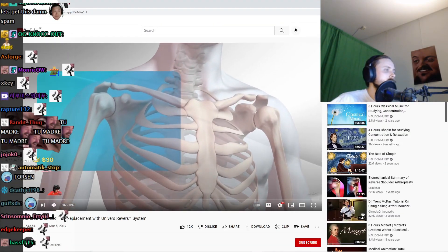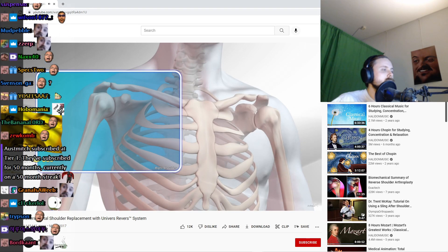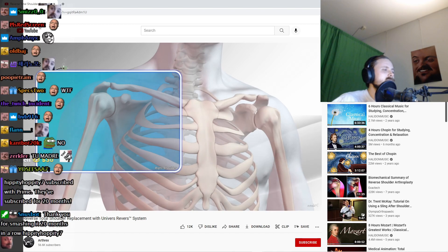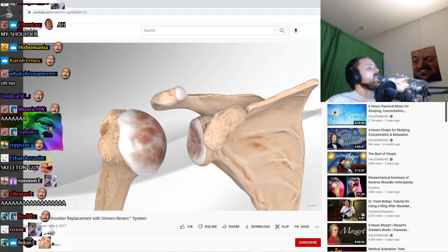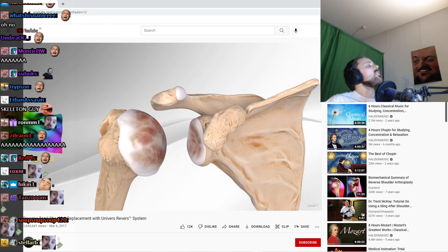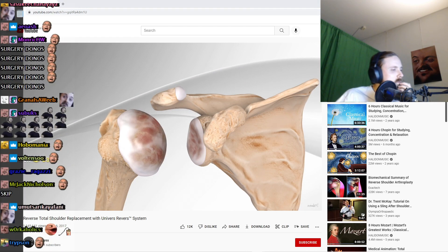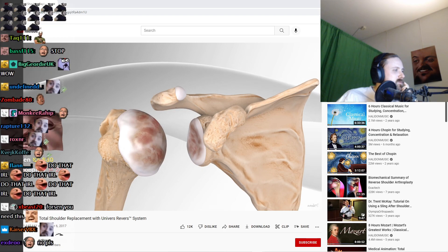In this video, we will demonstrate a reverse total shoulder replacement for rotator cuff failure with wear and tear arthritis using a reverse shoulder replacement system. The rotator cuff is a group of muscles that are responsible for helping move the shoulder. When they are damaged and not reparable, loss of function occurs at the ball and socket joint of the shoulder, causing pain and dysfunction.